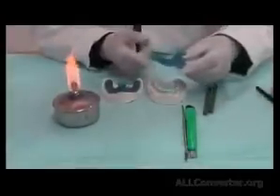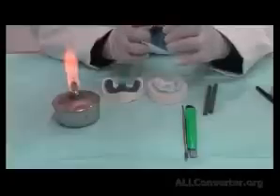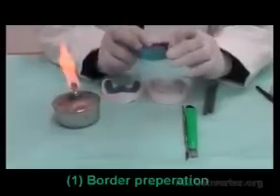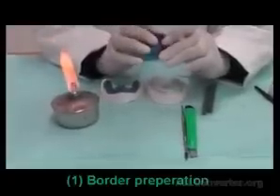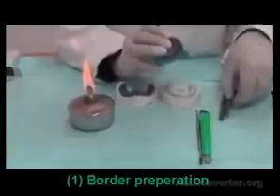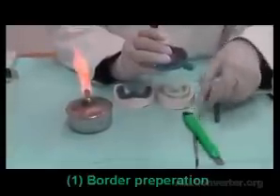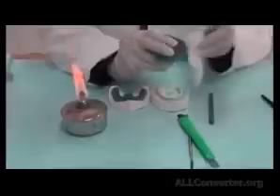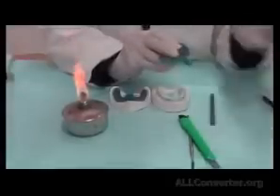When you were finishing the tray, we told you not to adjust a lot of the border area. We just need it to be free from sharp edges. We need it to maintain rough because we're going to add a green stick. Make sure that the border does not have any Vaseline remnants from your fingers or anywhere, because we need the green stick to stick to it. So we make sure that it's totally clean and free.